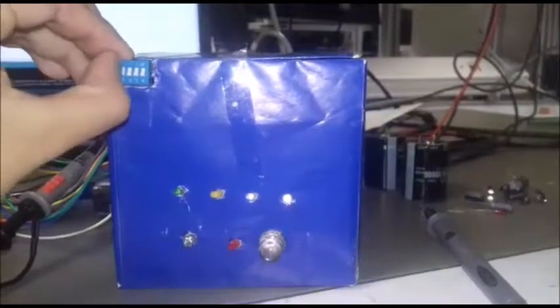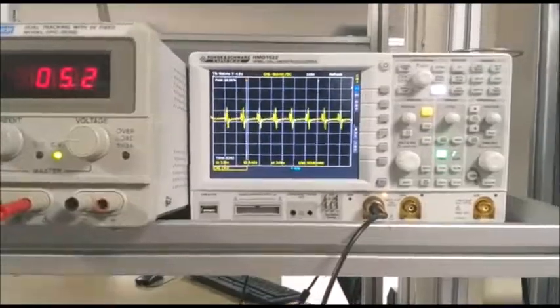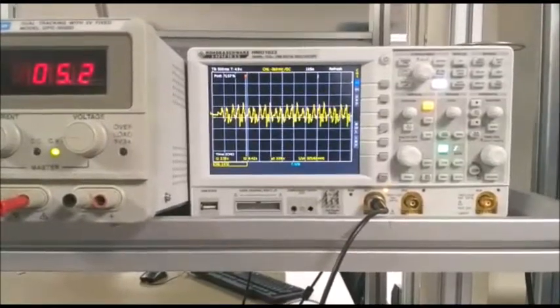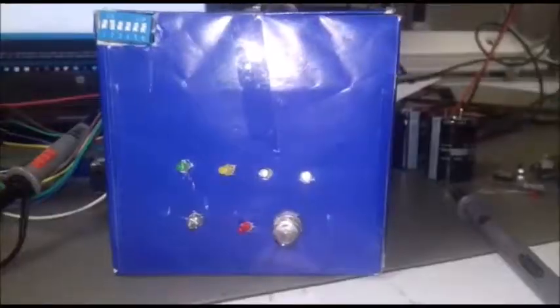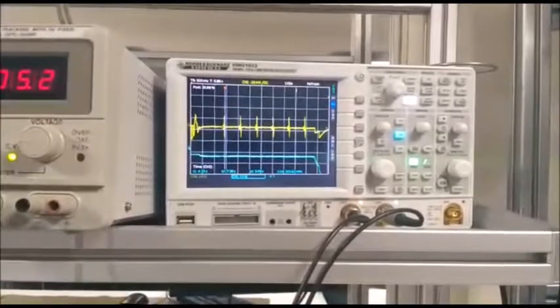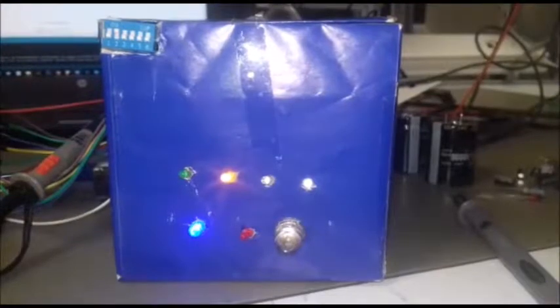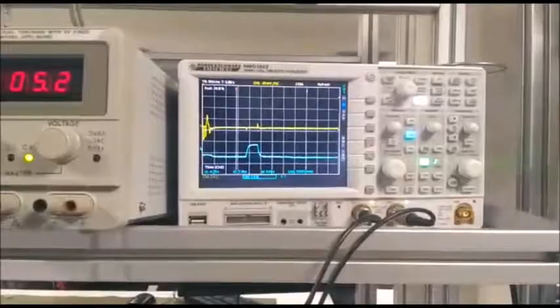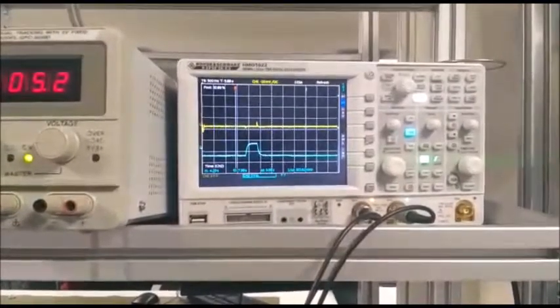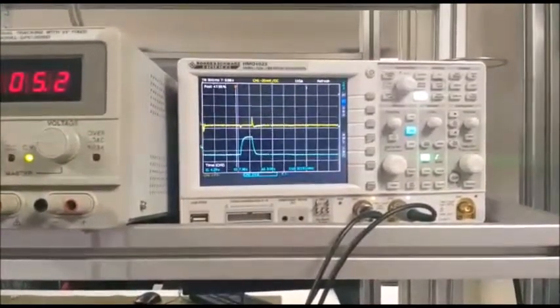In the second position, there is ventricular fibrillation. When selecting it, the signal that the patient has is read, and after that the yellow LED is turned on as the patient requires defibrillation. The first charge and discharge is done, equivalent to 17 joules of energy, and it is shown to the user on the indicator LED. After that, as the patient continues without signs, a second discharge is made, this time equivalent to 19 joules of energy, and the user is shown on the indicator LED.